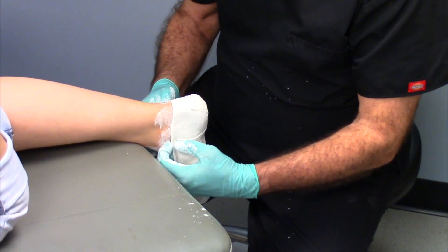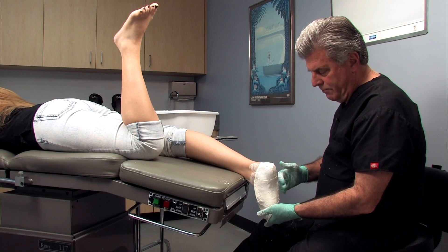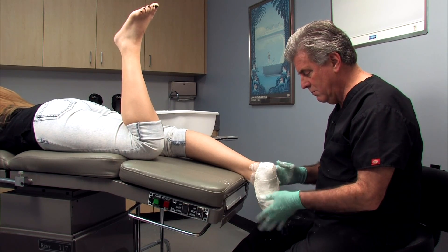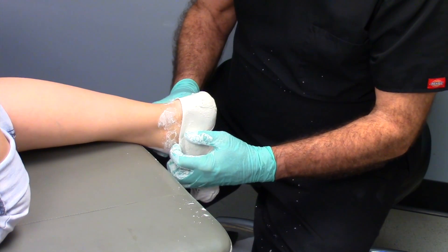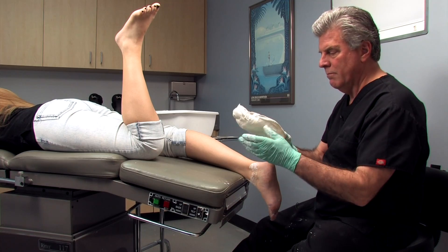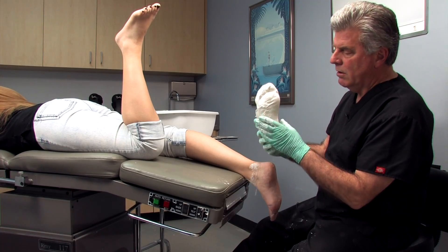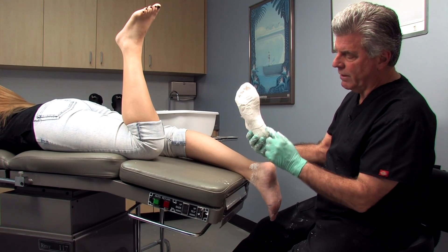The plaster has hardened to the point where we can go ahead and take it off the foot. We loosen it over the top of the foot. You might want to leave it on and go cast the other foot first, letting this harden a little more so it doesn't get distorted when you pull it off. We gently pull down on the heel and, working from the heel forward, lift it off the foot without distorting the forefoot. You can see the thumbprint, but by reaching inside and pushing it down while the plaster is still a little moldable, the thumbprint is pretty well gone. Take advantage of that right after you pull it off the foot for an accurate cast of the forefoot relationship to the heel.